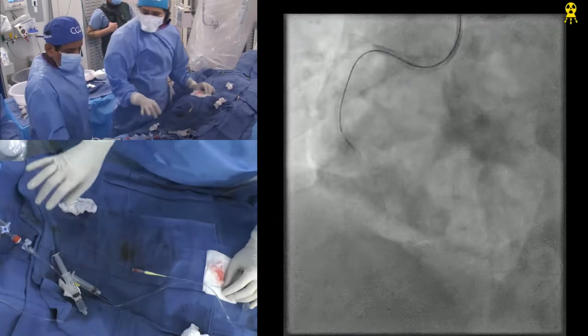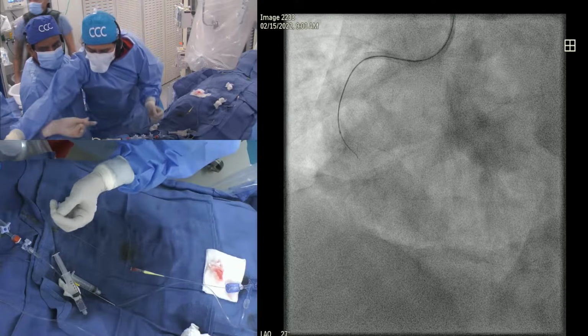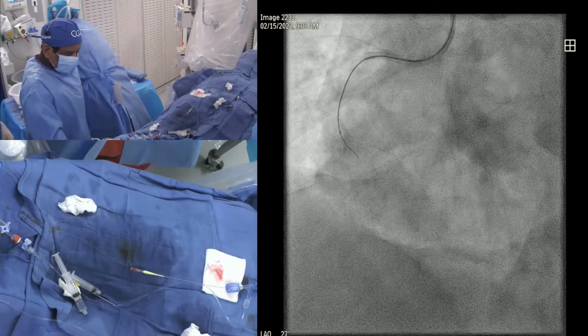Hornet? This is 14 now. First time we are going above. Well, like it's outside.